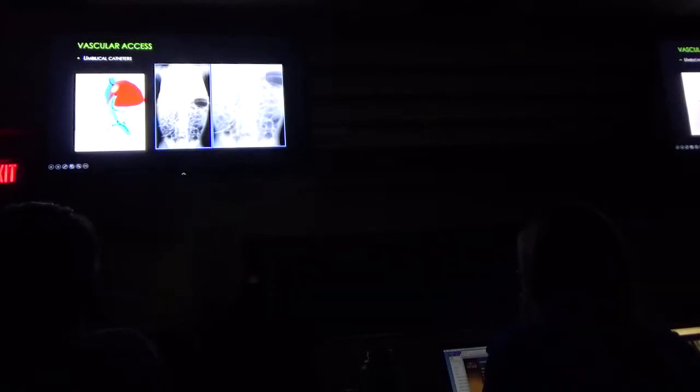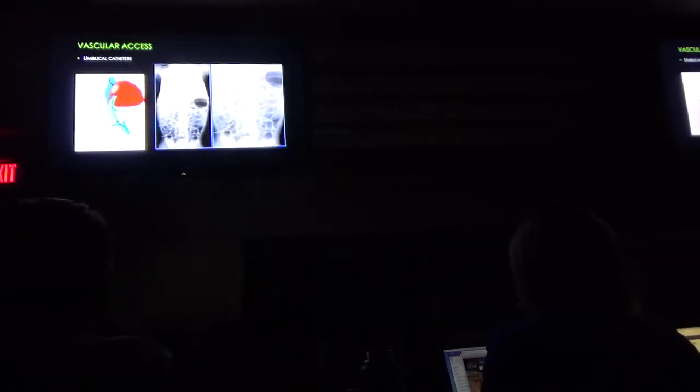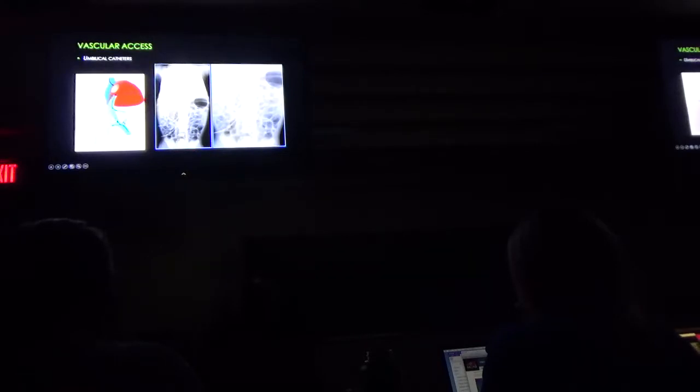So again, you're meeting resistance and you're trying to force it, just like a straw. I think Dr. Lovelace actually talked about this a little bit yesterday. It fractured within that vein just by the force of you trying to force it. So obviously that's not going to be working very well either. And then you've got a foreign body floating around. That's not good. Not figured out.